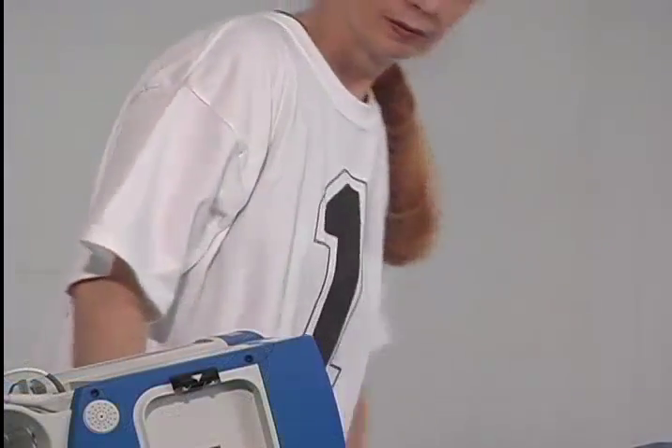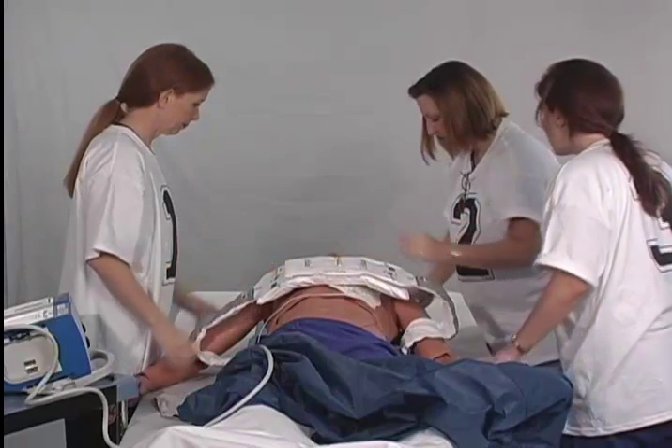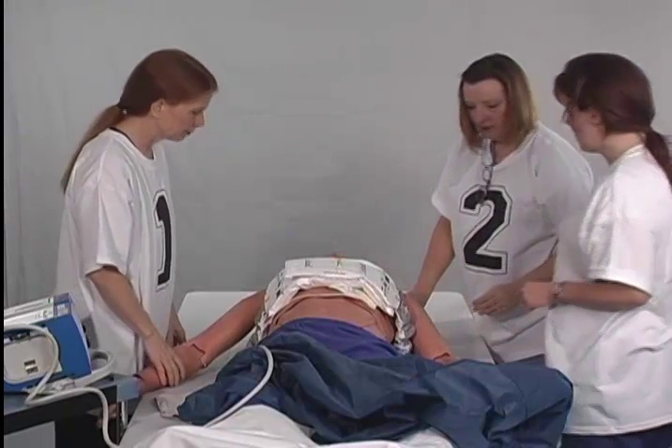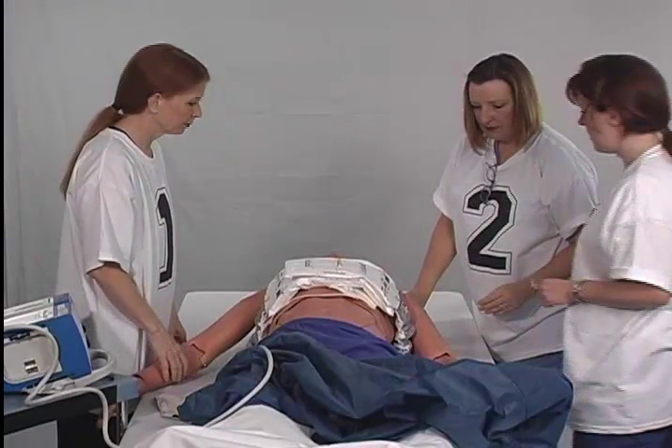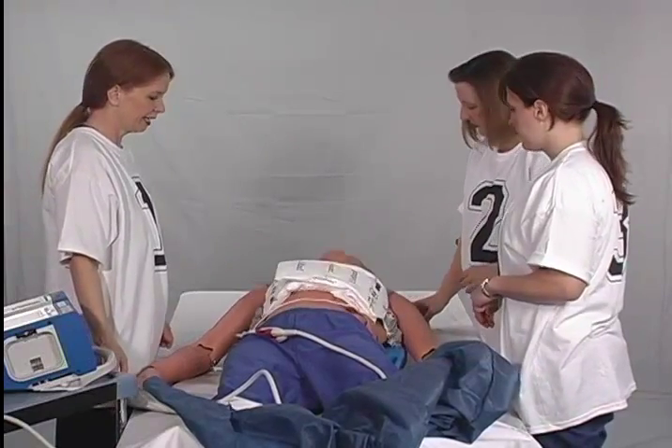If the hospital's protocol is to shock first, then a quick rhythm check is performed and a shock is delivered if indicated. If the protocol is CPR first, number two presses the green continue button. The autopulse sizes the patient's chest and determines the force necessary to compress the chest the prescribed amount. All staff members are careful not to touch the lifeband while the autopulse is analyzing. Upon the visual cue on the screen, number two verifies the patient is properly aligned, then presses the green start button again to begin compressions immediately.